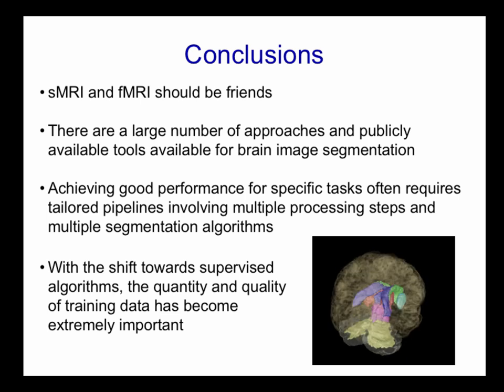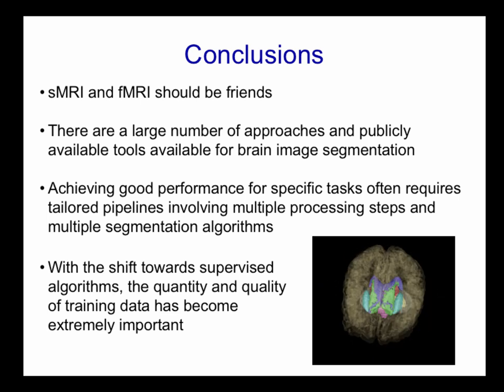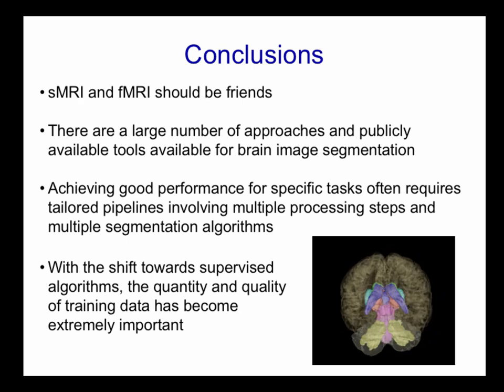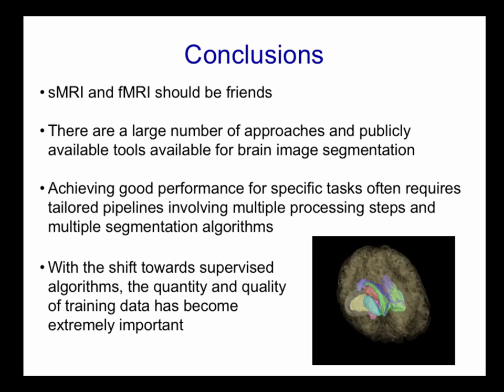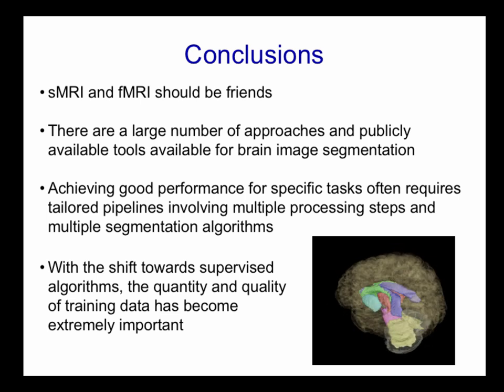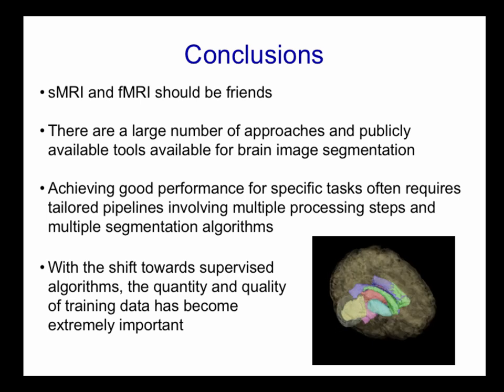So I guess it also depends. I don't know what the details of the algorithm are, what structures it was trying to find, but part of the process that makes FreeSurfer slow is not just the segmentation, but the cortical reconstruction process. And so if it's just finding the whole brain segmentation, then it's missing that last step that FreeSurfer does, which takes a lot of the time.